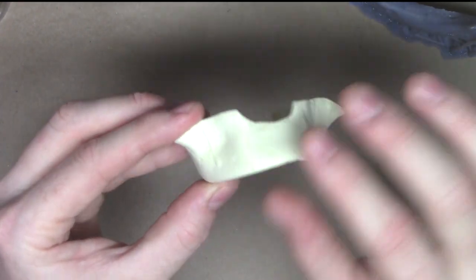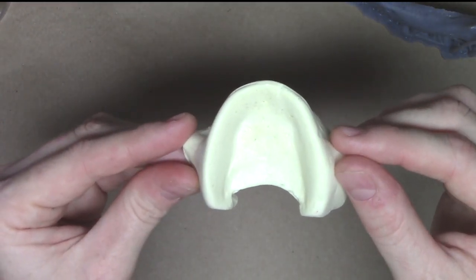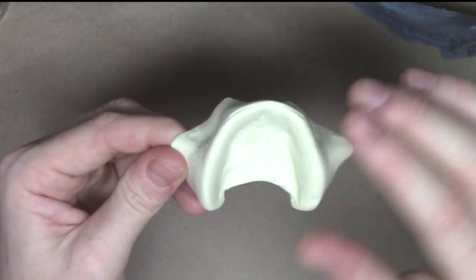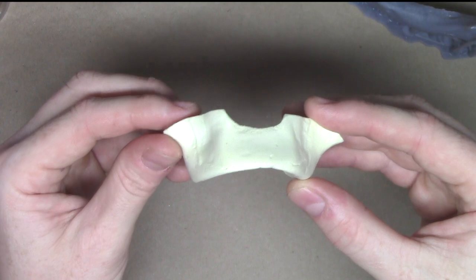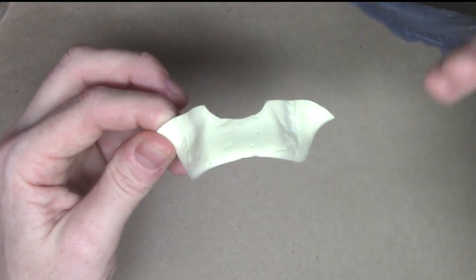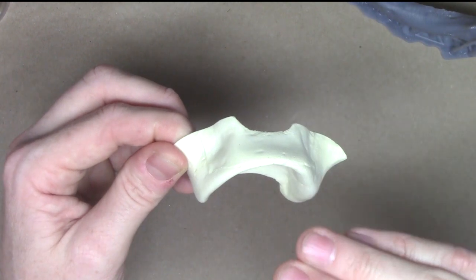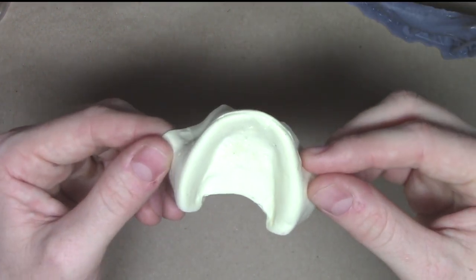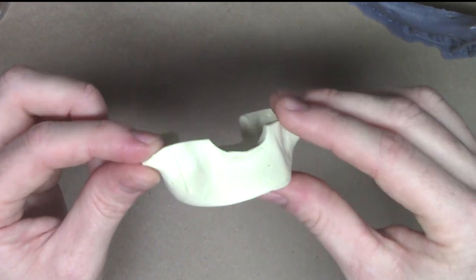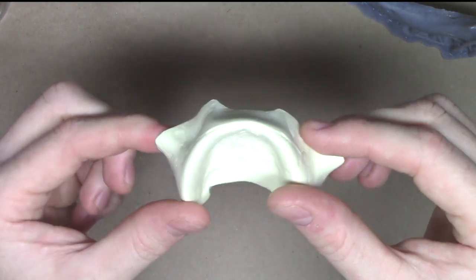And this patient, many times on the maxillary arch, is treated very successfully with a complete denture. And when those patients are treated successfully with a complete denture, they might seek out denture stabilization simply because they're okay with the denture, the aesthetics, the support and everything that goes along with it, but they might want to have increased stability. This would be an excellent example of where a narrow diameter implant would be more indicated than a standard diameter implant.